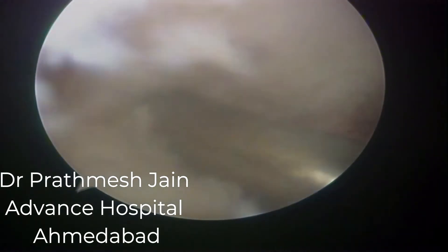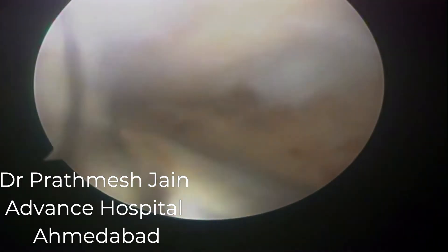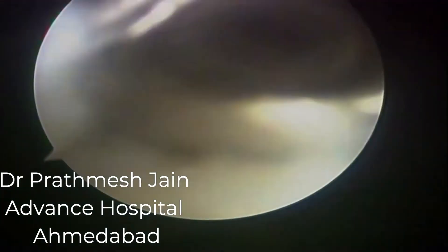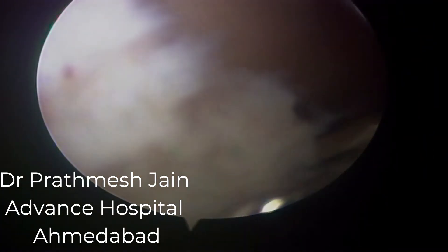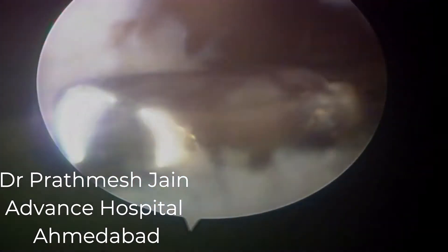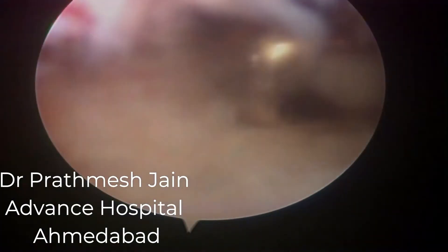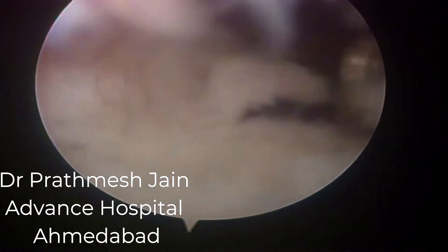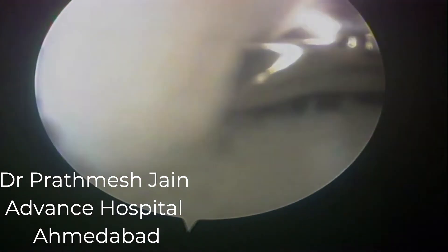Adhesions are released from center to periphery. We slowly go from the intercondylar notch area to the lateral gutter, which was the most pathologically affected area in this patient — being in the vicinity of the screws and the plate. We start the resection with the shaver but may need arthroscopic scissors and punches to release the dense bands of adhesions. Here this is almost like a sheet of dense adhesion at the level of the lateral femoral condyle, which is nicely released with the arthroscopic scissor punches.